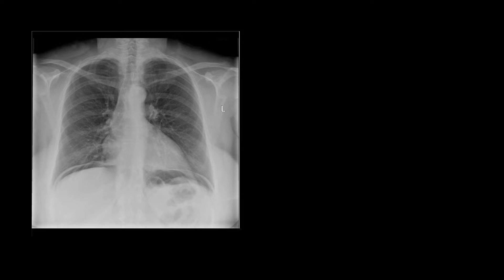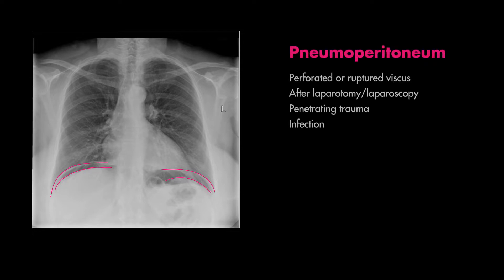Keep in mind that air immediately underneath the diaphragms on a chest x-ray is not normal. This is suggestive of a pneumoperitoneum, usually from a perforated viscus, as in the case of a perforated peptic ulcer. In this case, a surgical consultation is required as this patient may need to go to the operating room.